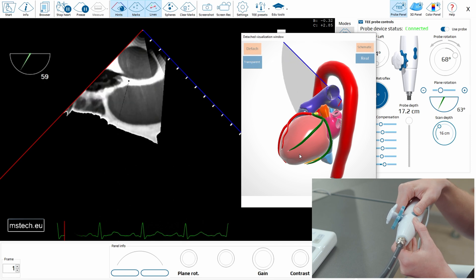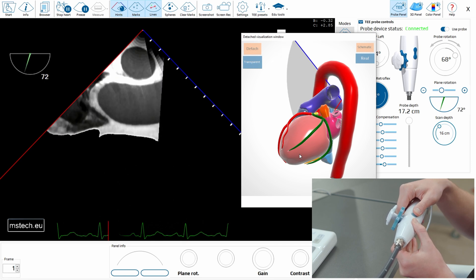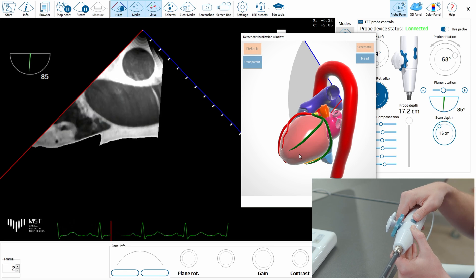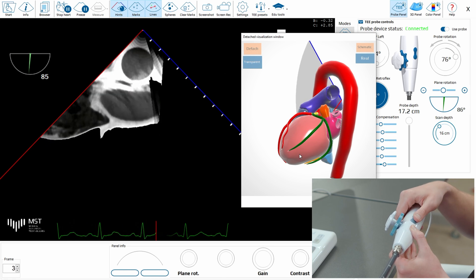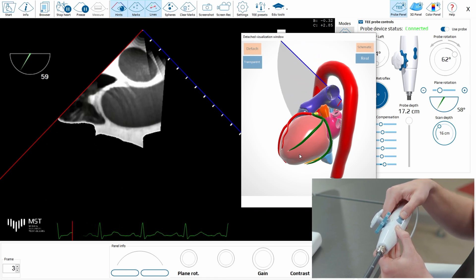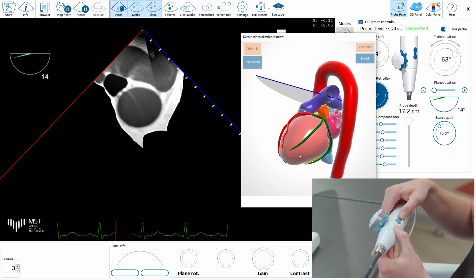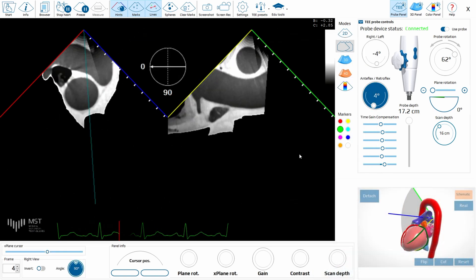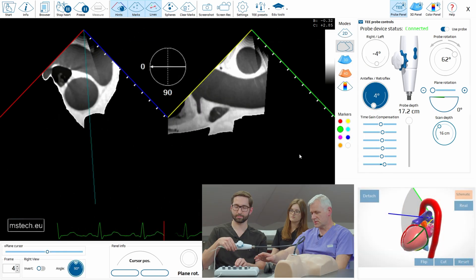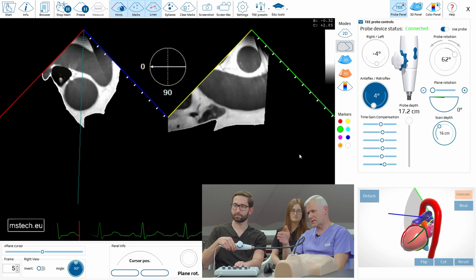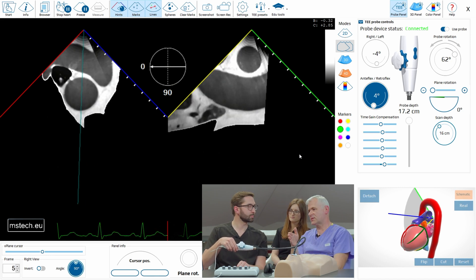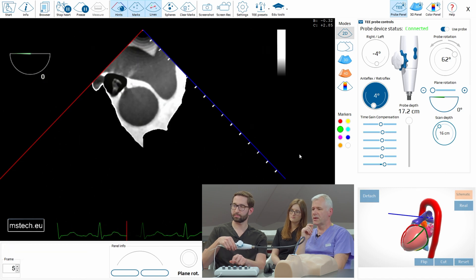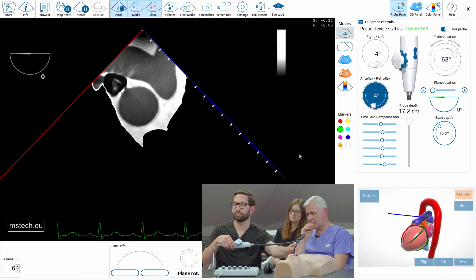So you told me to rotate to seek for the longitudinal view of the ascending aorta. Good. We can do it like this or by plane view, but you have to be certain that you cut the aorta in the center to see really the size of the aorta.